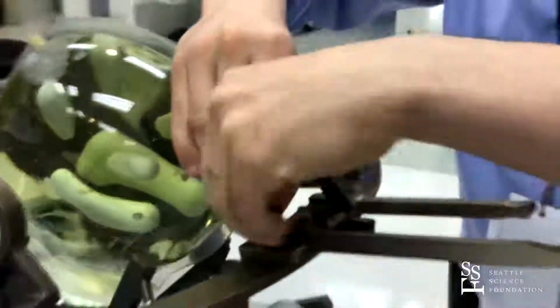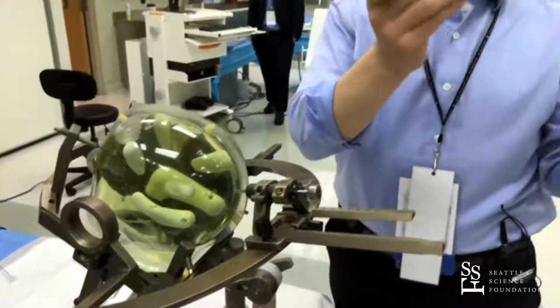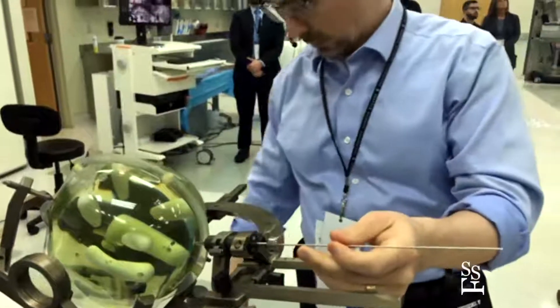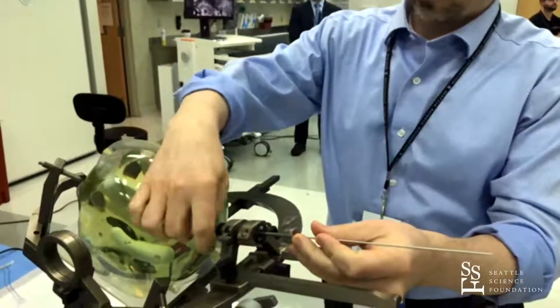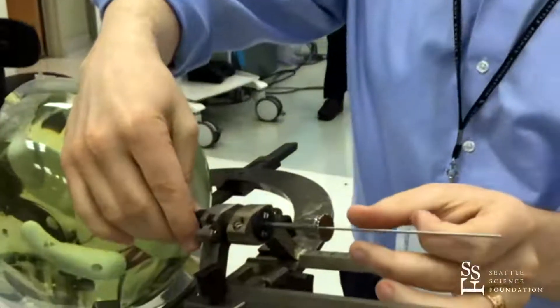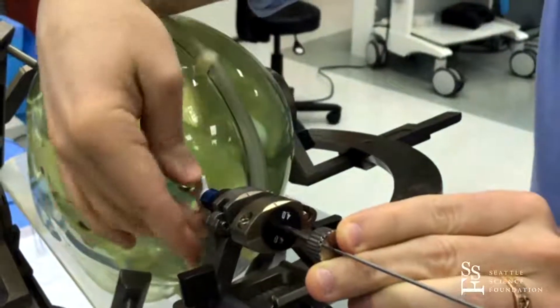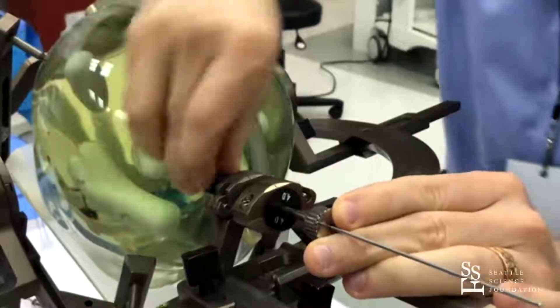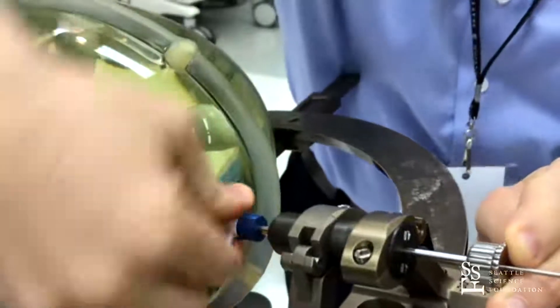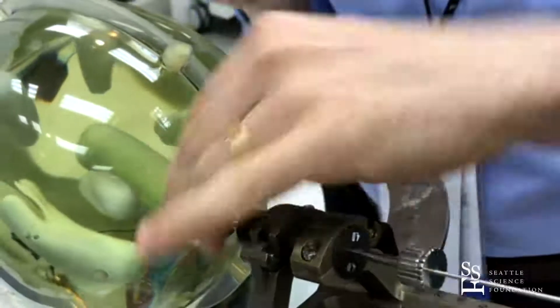We can raise this up to give ourselves some working space to get the bolt in. This has an additional reducing cannula that allows us to put a stereotactic alignment rod that will hold our bolt in place. This cannula goes inside the larger cannula. The aligning rod passes through the bolt and down just inside the hole we drilled in the skull, and holding this in place allows us to align the bolt as we feed it down on the alignment rod and screw it into the skull. The aligning rod is maintaining the bolt along the desired trajectory.